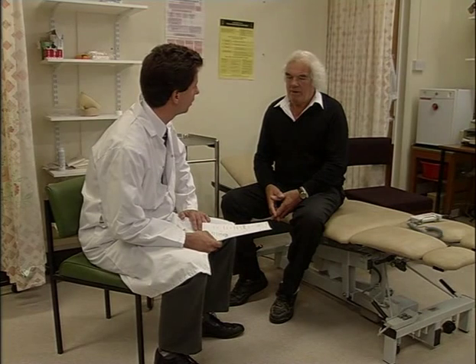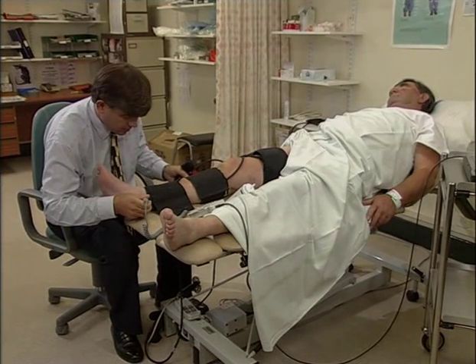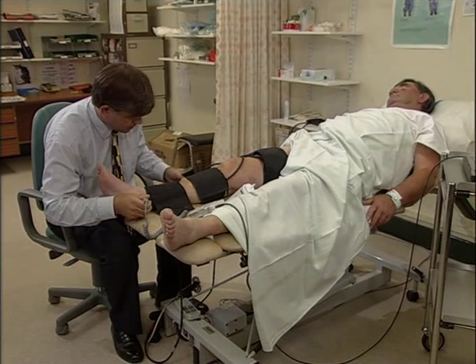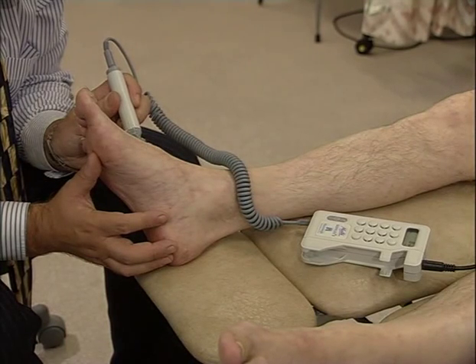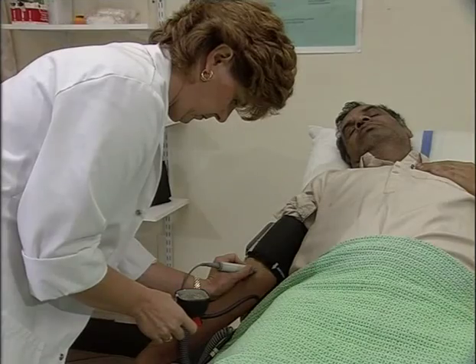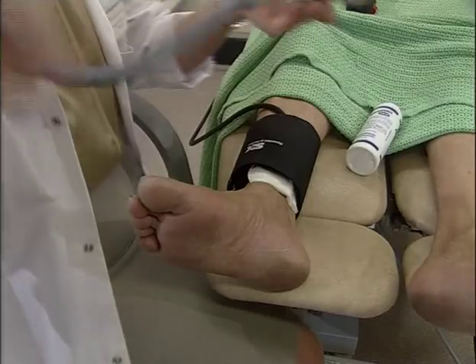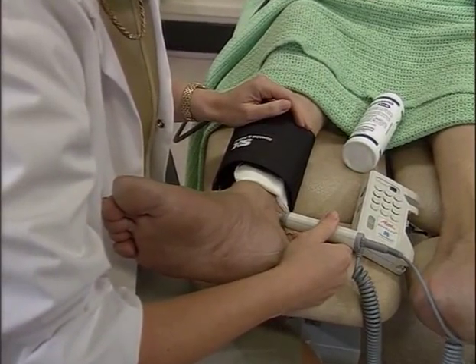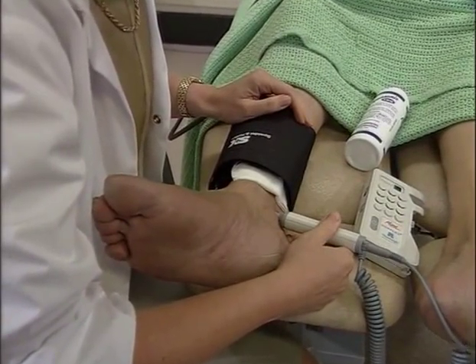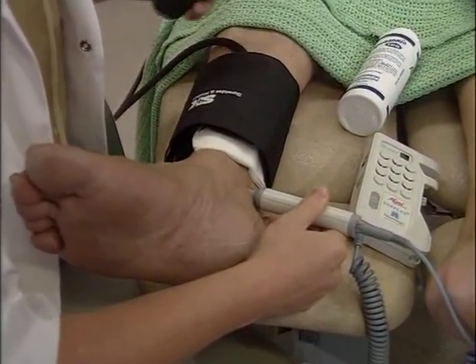A handheld Doppler is capable of providing valuable information about patients with arterial and venous disease of the lower limbs. The equipment is portable and cost effective. To demonstrate its versatility, this program shows its use in a number of key application areas, including the ankle brachial pressure index as a valuable indicator in the assessment of a patient with suspected vascular disease or a leg ulcer.